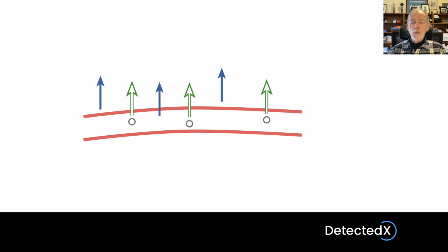So this is the idea, that we have a blood vessel with contrast bubbles, and I've shown those as little circles within the bloodstream. I have got scattered echoes coming back from the bloodstream and also the surrounding tissues, and only some of these echoes will be distorted, and I've highlighted those with the green arrows. So it's only the echoes coming from the gas bubbles that are distorted. When we use harmonic imaging, the only echoes we'll see are the echoes coming from the gas bubbles. Harmonic imaging automatically enhances echoes from gas bubbles.